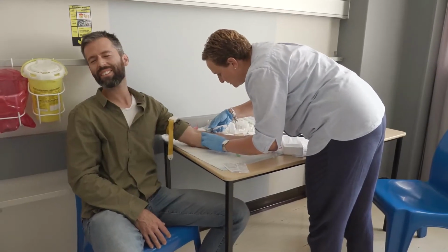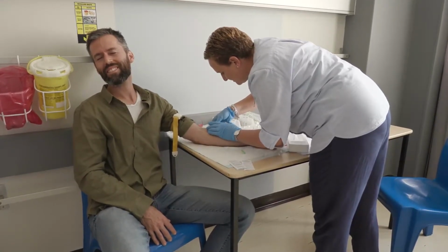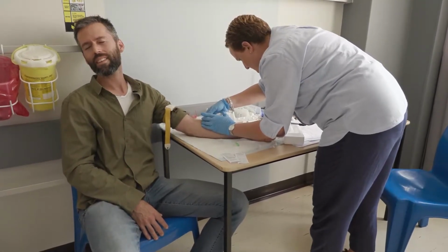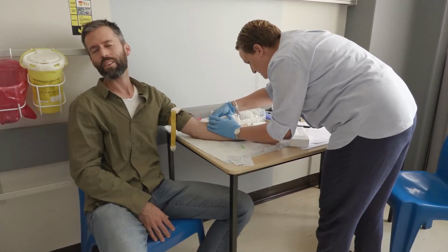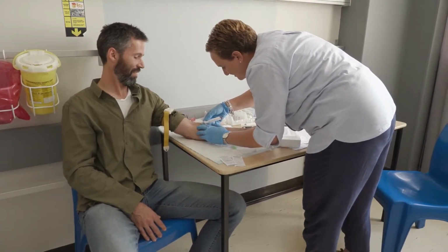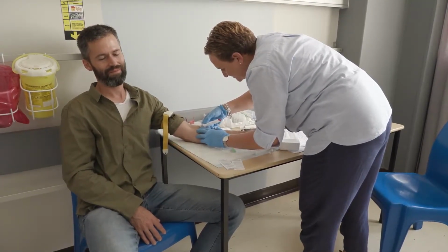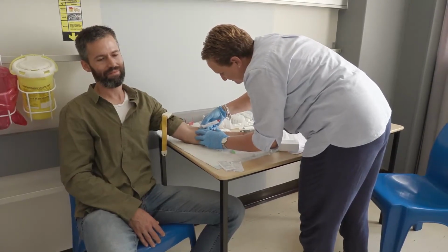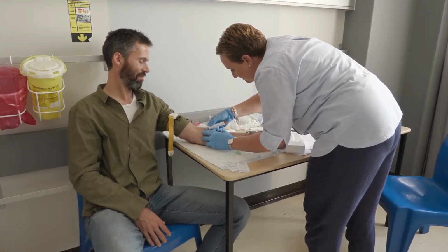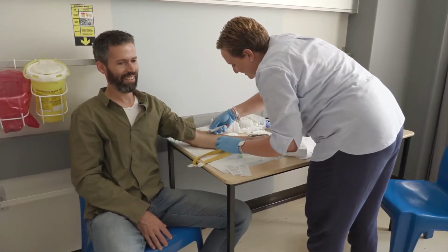So, doctor, I'll look away. Yeah, don't look. Small scratch. Sorry. You're good, doctor. Perfect. You're getting some. Can I look? Come on, quick. That's it. Oh dear. There you go. Perfect. That's a lot of blood, doctor. I know. There you go.